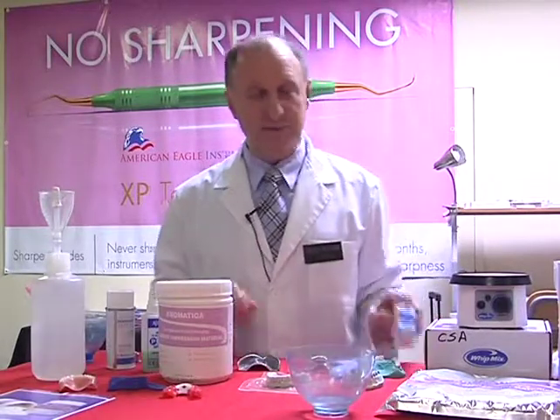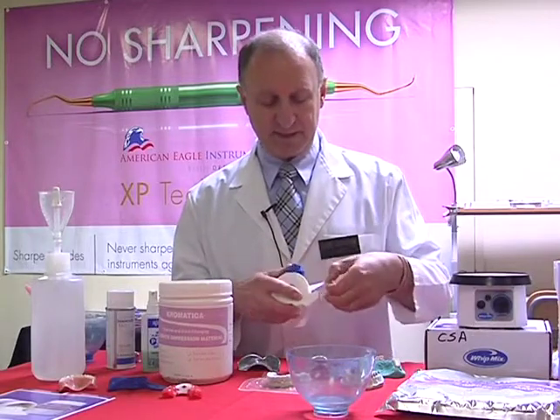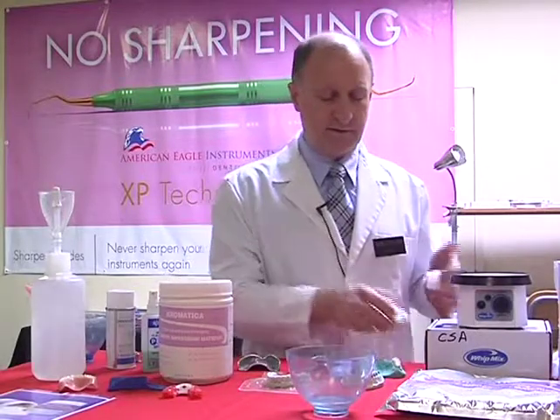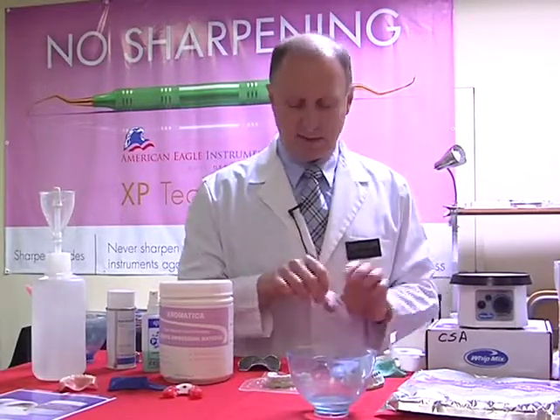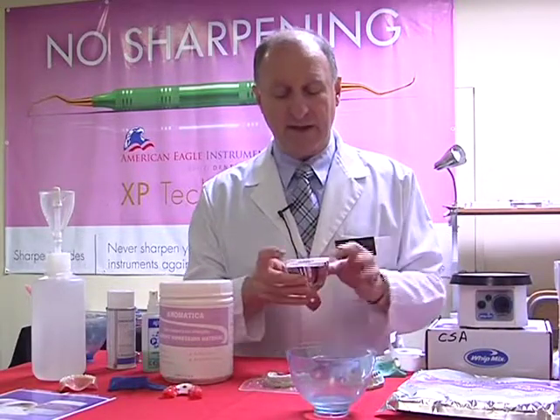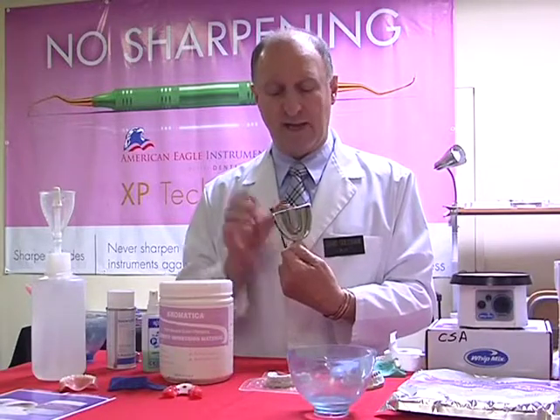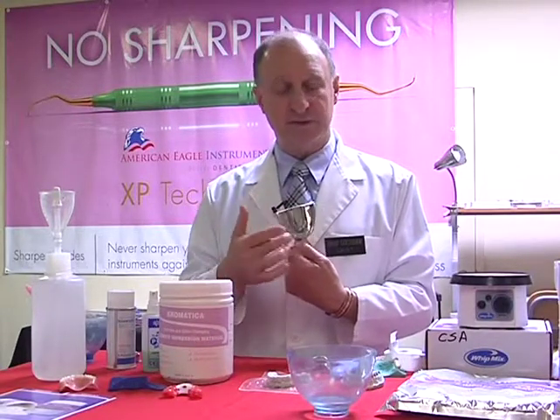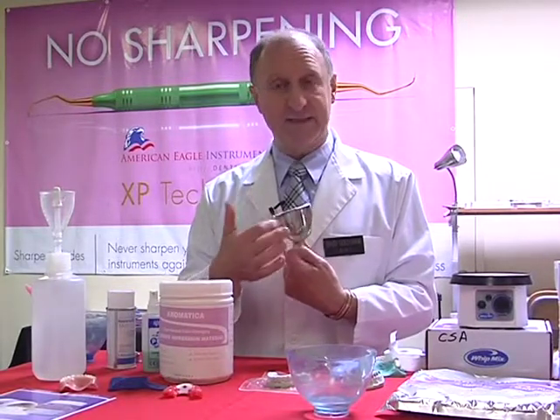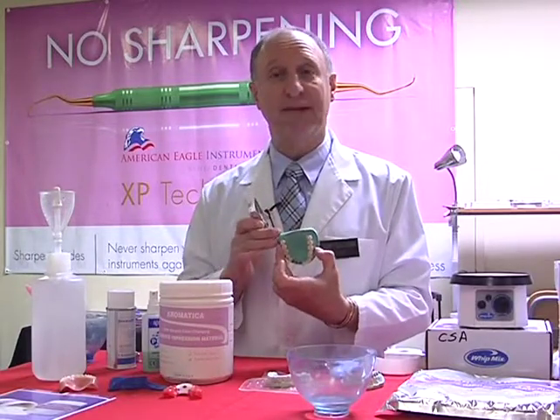I'm going to use a material called Damit. Damit is a great little material. It's actually a fiber-based product. As I pull off a small piece of material and close this off, I then apply that to the posterior border of the tray. I then fold this over with a light pressure, and it's now sealing the back of the tray. In this way, it's going to hold the material within the tray, allowing it to compress more and pick up the distal areas, which are normally lost as the material drags or flows out the back of the impression tray.